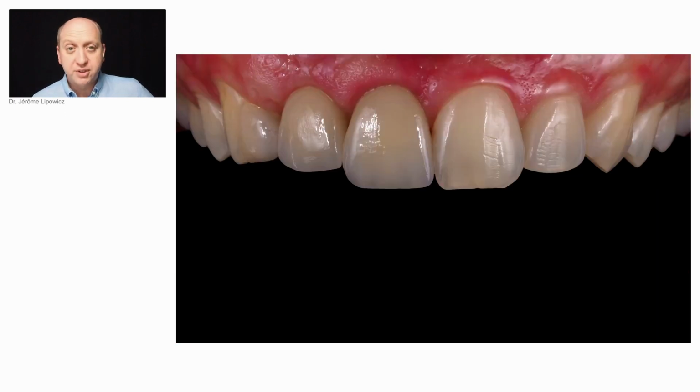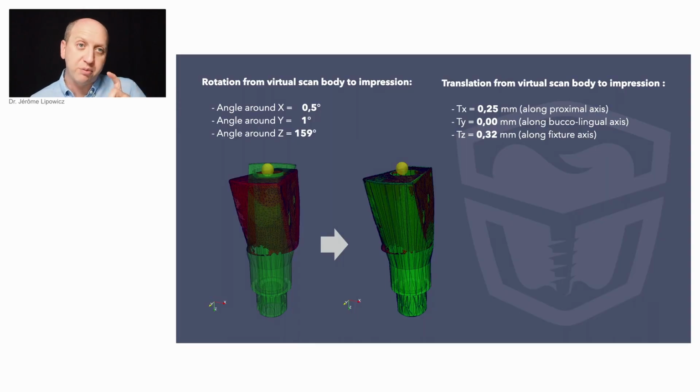The most interesting part is that we compare the scan bodies from the implant planning and from the impression, and I can say that the results gave much satisfaction.